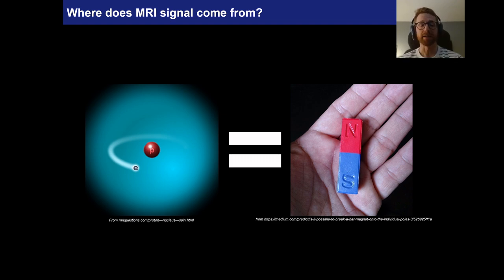In nuclear medicine, we inject patients with radiopharmaceuticals that undergo radioactive decay and ultimately lead to the production of gamma rays, which we can then detect with gamma cameras. So MRI is totally different. We don't have to shoot X-rays at a patient. We don't have to use an ultrasound transducer to send sound waves into the patient. We don't have to inject them with radiopharmaceuticals that emit gamma rays. We just use the patient's own hydrogen nuclei and their water and fat to be able to generate signal.